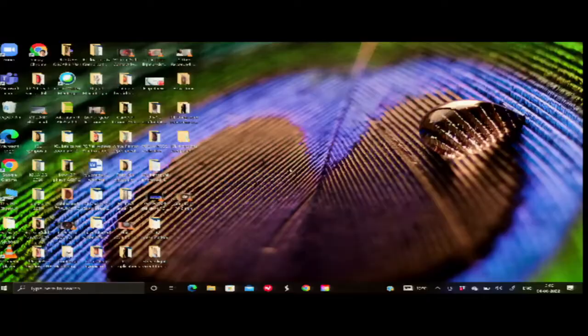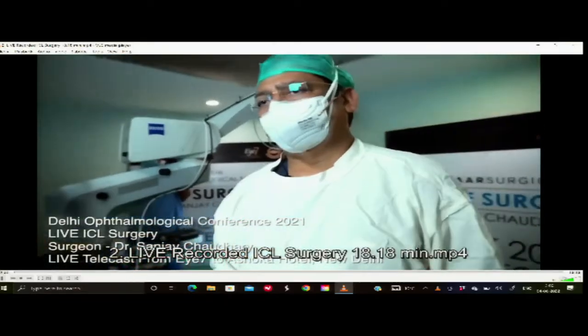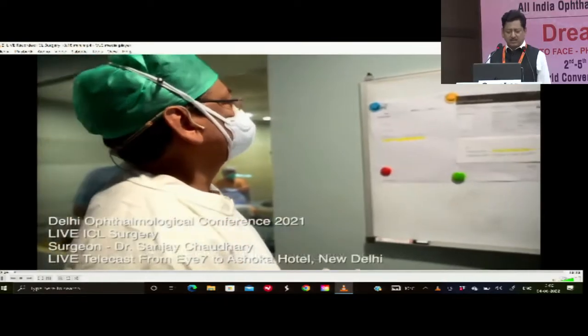Okay, yes or no. So I'll just move on to this presentation. It is actually the STAR people, I think they saw this presentation somewhere live and they were very keen that it covers a lot of things which youngsters who are beginning with the ICL need to know. So it was a good idea to take them through this recorded version to get an idea of how to go about putting an ICL.